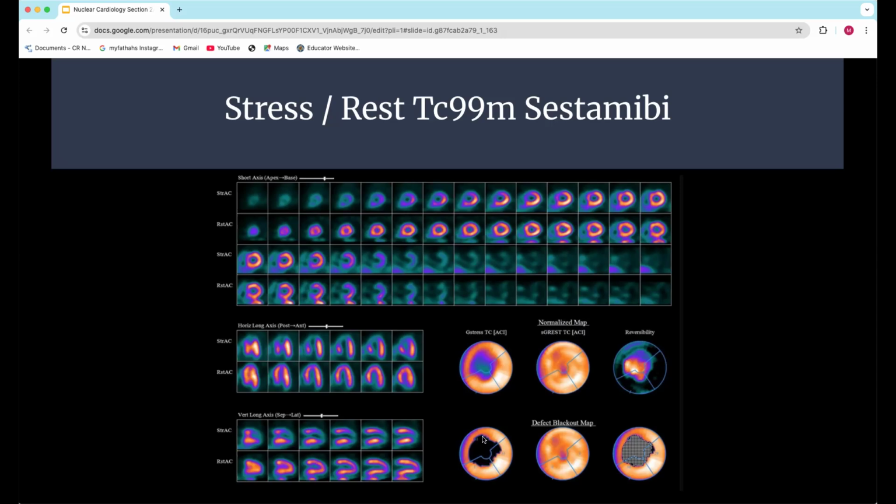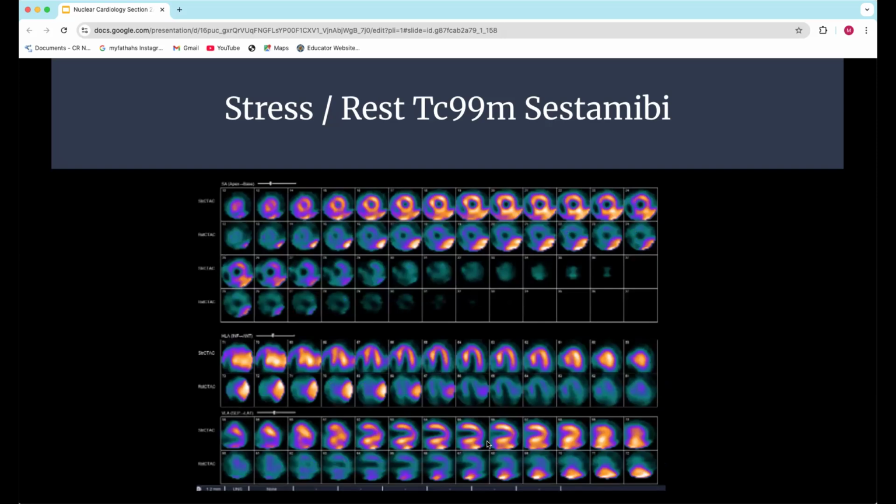Now, what would be interesting is if this defect were kind of small and located perfectly apical, it might be more of a question because you don't know. You're looking at this and you're like, the circ over here could be involved as it swings down and comes around. Most likely it's still LAD, which is why they do this little half circle. But the smaller that defect gets towards the apex, the harder it can be. When it's out towards the base, it's much easier to figure out, right? So good, very good.